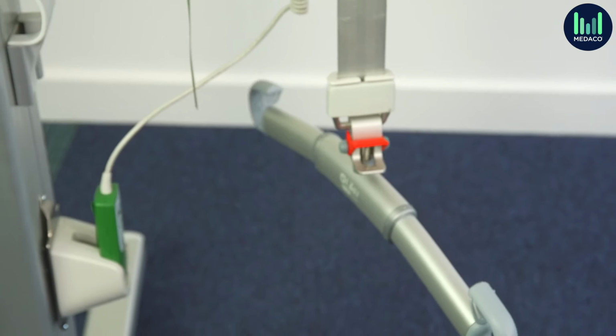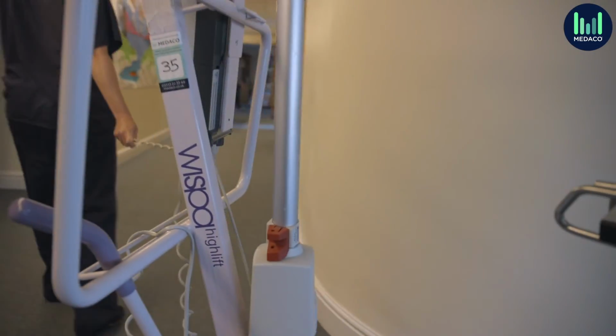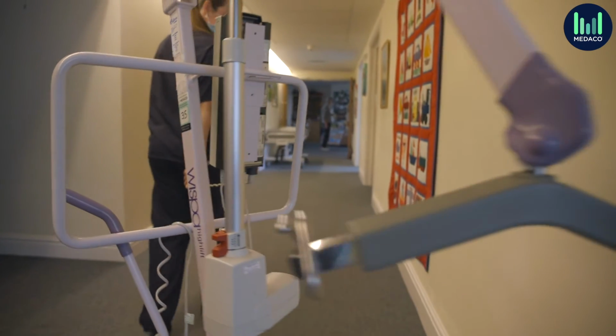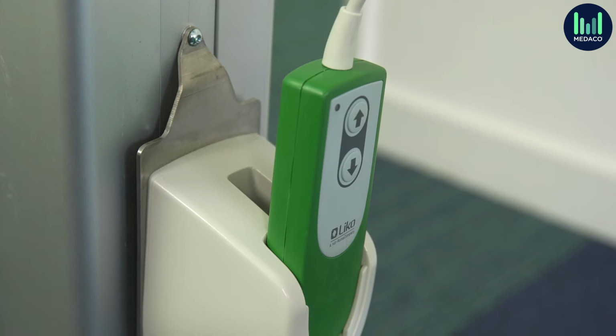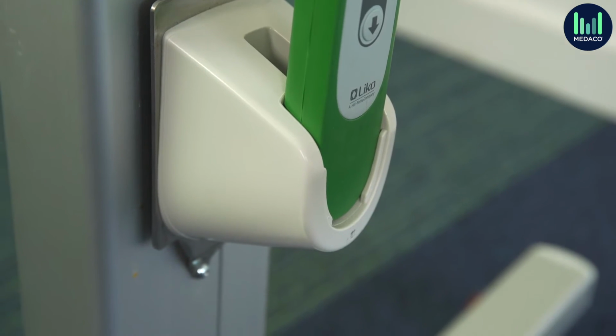Handsets on care equipment are durable, but they can receive heavy use in certain environments. Staff can sometimes use handsets to pull the mobile hoist along instead of pulling the hoist by the handles. As handsets aren't designed to be pulled, it causes the handset wires and connections to come loose or break. Staff training is key to reducing this issue and reducing the unnecessary costs associated with handset breakdowns or replacement parts.